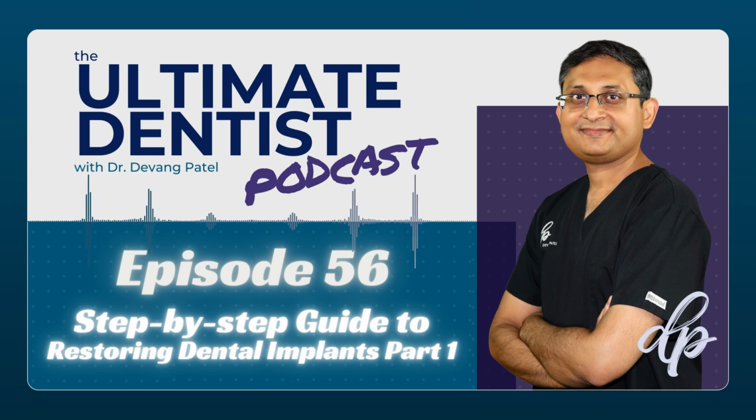Now, this is something you may not be able to decide. Your implant surgeon might do digital planning and then decide. So when you are discussing this with the patient, you need to really give the patient an idea. Generally, I will give the patient an estimate with 2 implants, but just say that if it's possible, we might do a cantilever. And many times the patient would come and say, oh, can you not just place 1 implant and do 2 teeth, because obviously it's cheaper. But I always tell the patient that, look, yes, you'll probably save 1,000, 1,500, whatever pounds. It's just not worth it. If you can place 2 implants, it's best to place 2 implants for support.